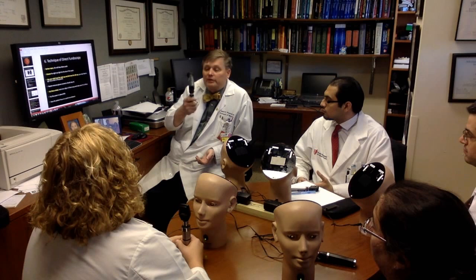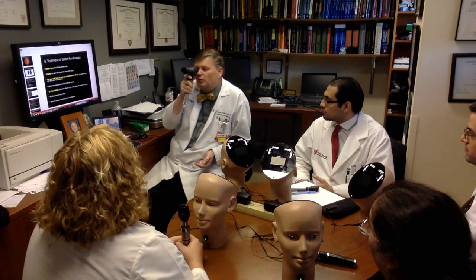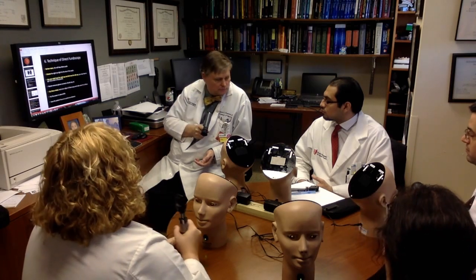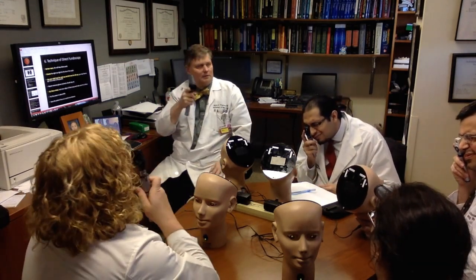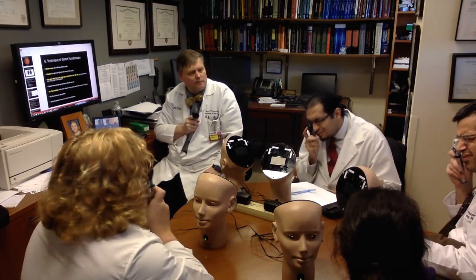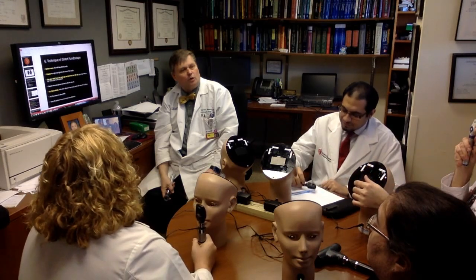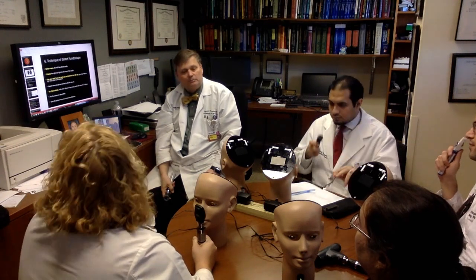Now, this is one of the most important things: look through your ophthalmoscope at something approximately 10 feet away, go ahead, and then focus. Turn your wheel until whatever is 5 or 10 feet away is in focus. So go ahead and do that. It's not the hand thing? Well, you can do that too. I would do it more like 5 feet away. Just pick a spot someplace far away and make it relatively in focus. Or even like here, look over here, relatively in focus. You know what I mean? That will take care of the refractive error in your own eye. Okay? All right.